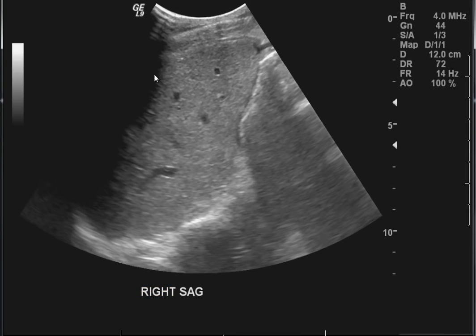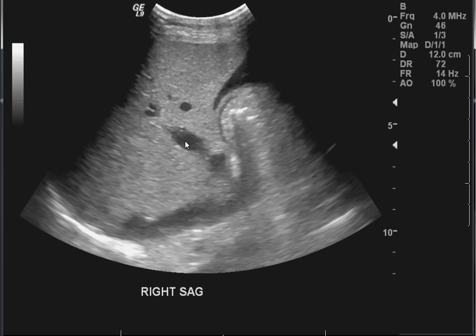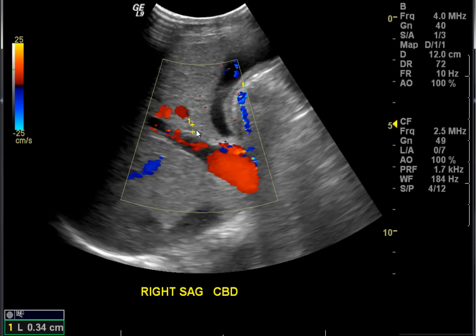Okay, so one of the things to remember is the liver is unfortunately at risk of becoming fatty infiltrated. And when we image and the liver is fatty, it is more echogenic than normal. You can see some of these artifacts again entering into the gallbladder from the outside in. So here we're getting to the porta hepatis. This is a sagittal display. The intrahepatic cava is on the undersurface here of the liver, and this is the main portal vein.